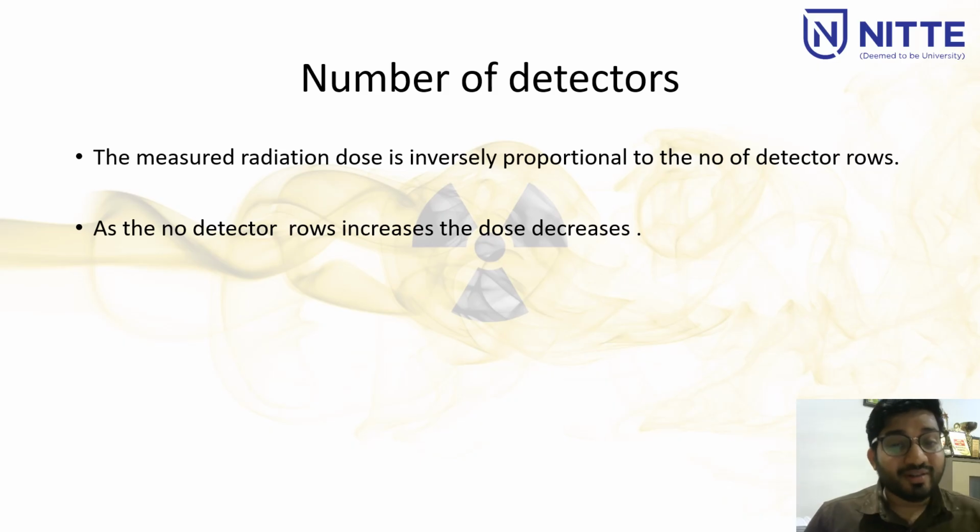There are more radiation dose reduction strategies and techniques, which will be explained in the next session.